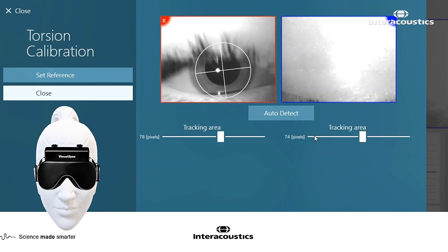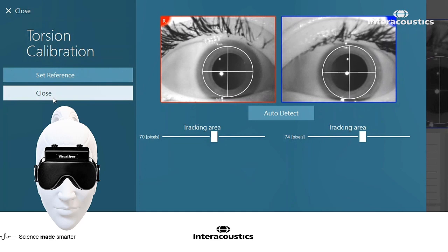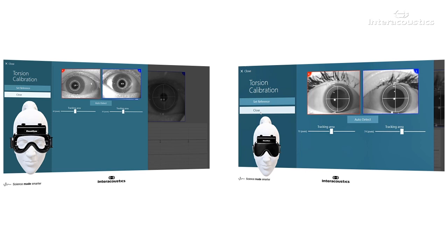If the reference for torsion is set when the goggle cover is off, like you see in the image on the left, the pupils will be small, as will the reference area. But for best tracking conditions, set the reference in the same condition as testing will be performed, with the patient wearing the light-tight fixation-free goggle cover.